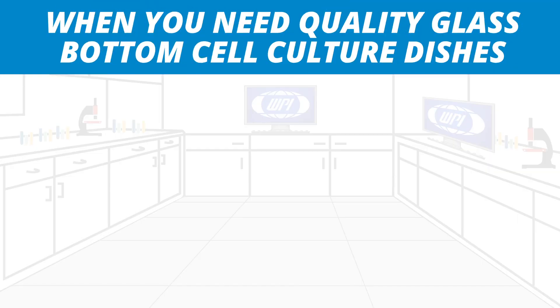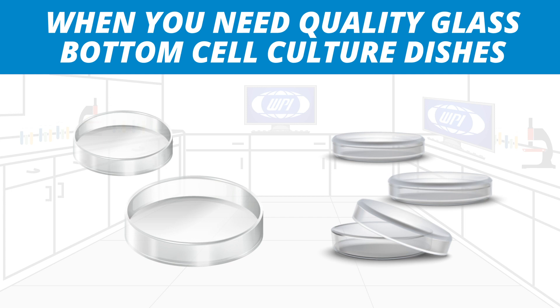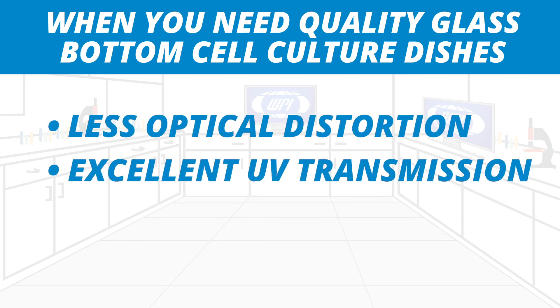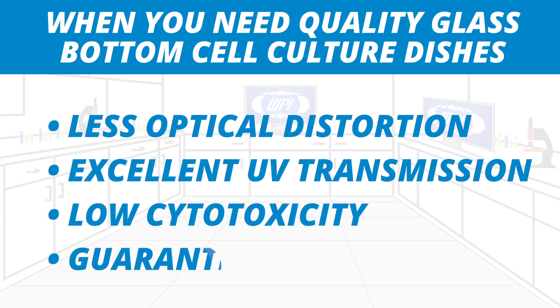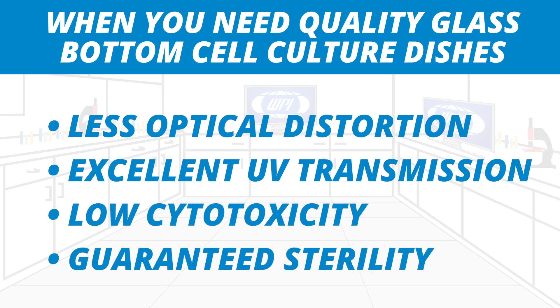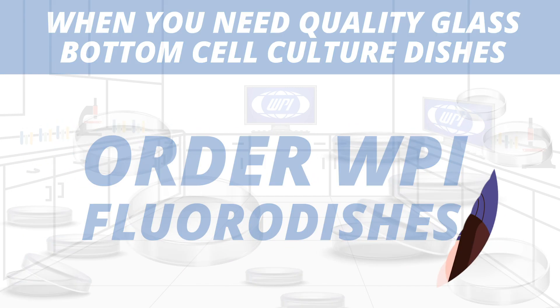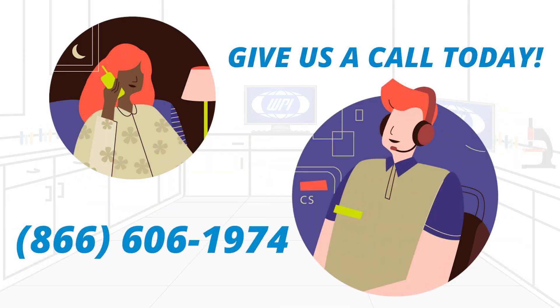When you need quality glass bottom cell cultured dishes with less optical distortion, excellent UV transmission, low cytotoxicity, and guaranteed sterility, order WPI FloraDishes. Give us a call today to discuss your application.